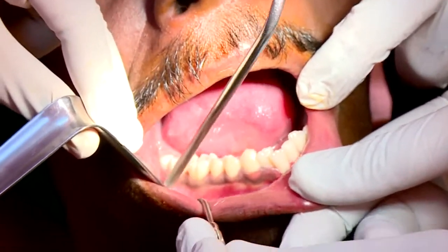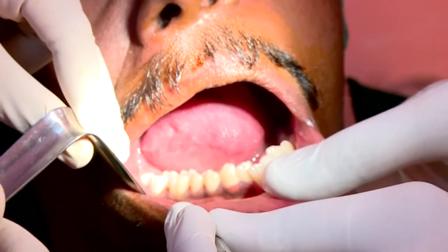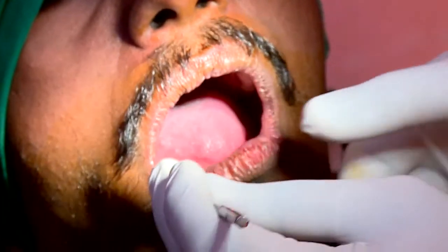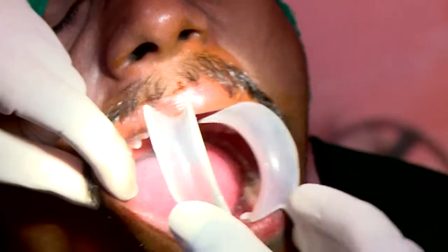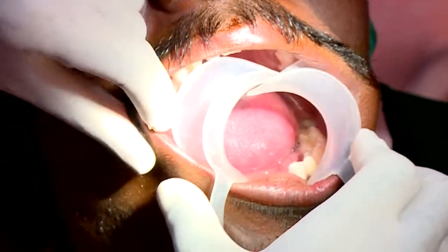Yes, sir. Continue. Sir, since it is a horizontally impacted tooth, what incision am I going to use? A modified Ward's incision, sir. The reason is that a slightly larger amount of bone removal is required in this case for application of the elevators.